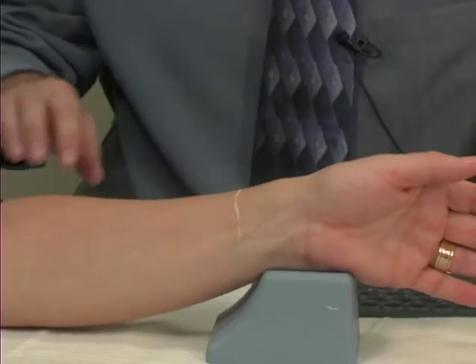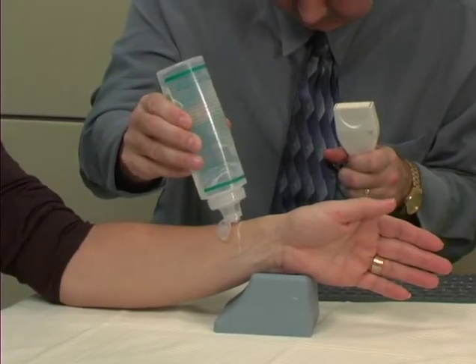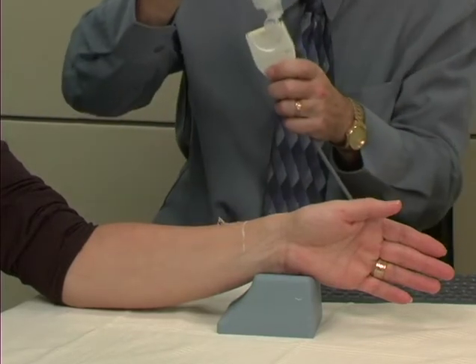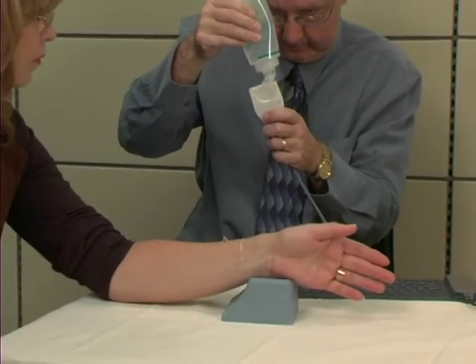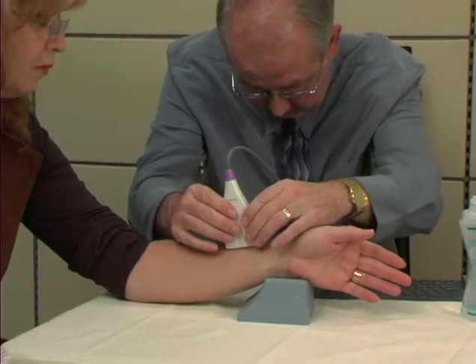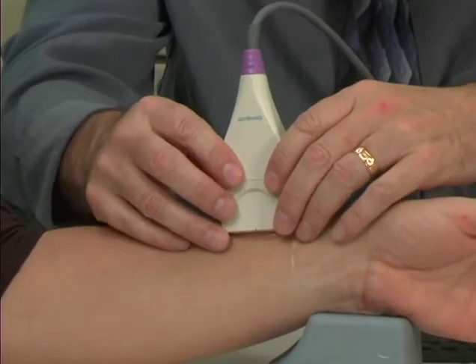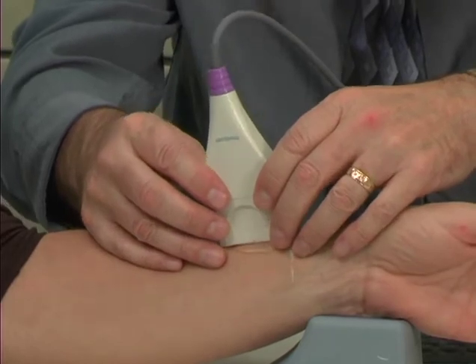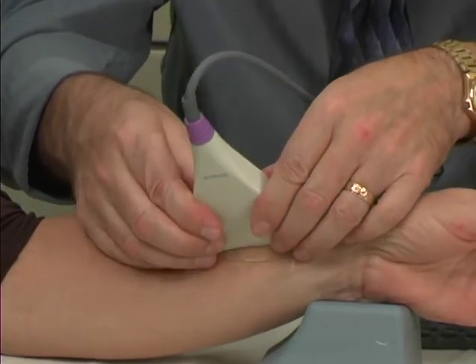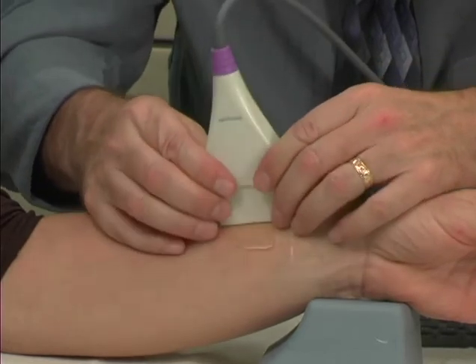Now the next thing I need to do is take some of the lubricant — it may be a little cool. I'm going to put a little bit on your forearm here, and I'm going to put some on the probe. I'm going to basically just get the connection going first before I start the measurement. Now you'll see that I've got my first, second, and third fingers holding the probe and my third and fourth as a guide. I'm going to run the probe along down 70 degrees to this side, 70 degrees to that side as it measures, trying to keep the probe itself flush to the skin the whole time and perpendicular to your arm.